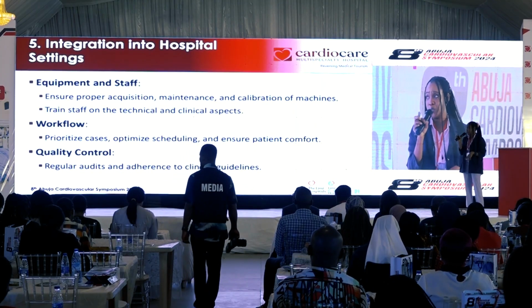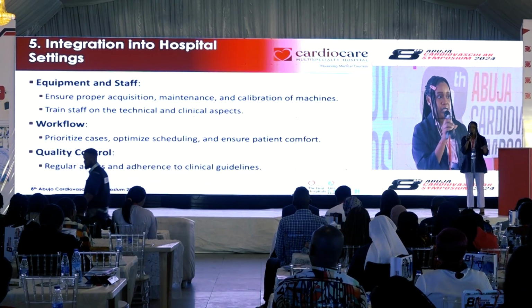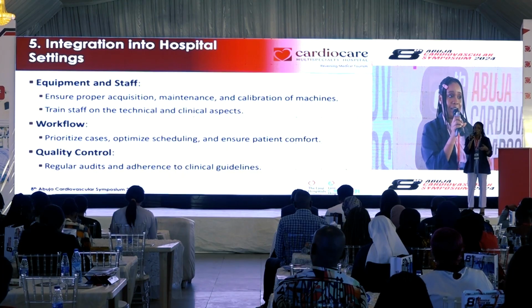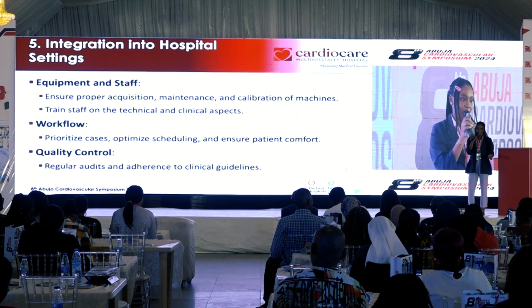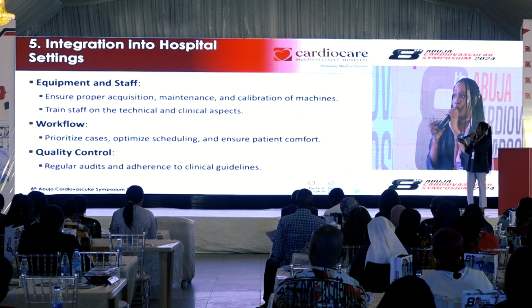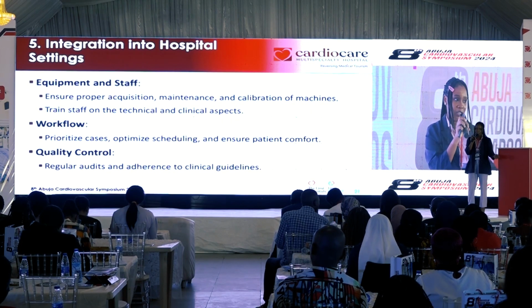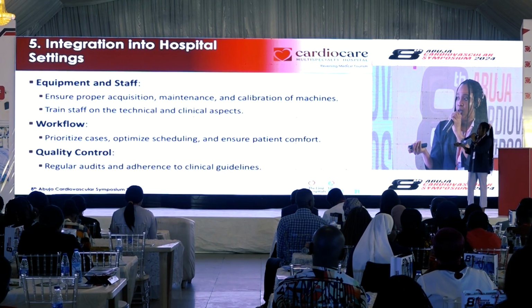And it's very important for you to train your staff on technical and clinical aspects. So that's why we host things like this. We teach people what to do, what not to do, what to expect. You'll be surprised that even down to our front desk staff, they know how to do an ECG, because maybe I'm not there, another of my colleagues is not there, and they're running around the hospital. That time they are wasting, they will use to do something else. So it's very important to train all your staff to be able to carry out all these procedures. And it will help your workflow. In fact, if someone can start your ECG before you are raising other tests, it will make workflow very, very fast. Quality control.